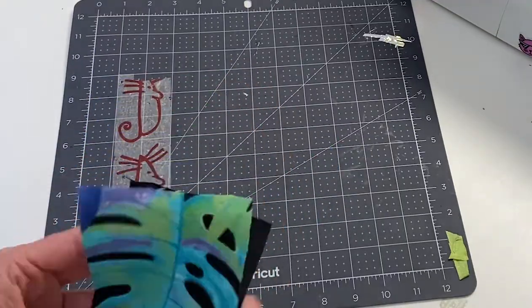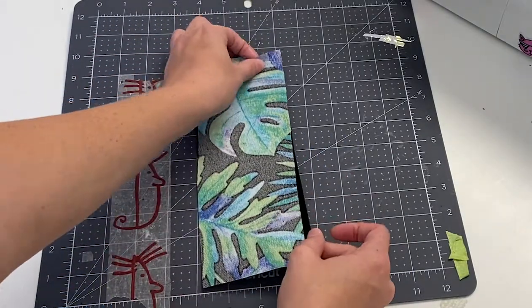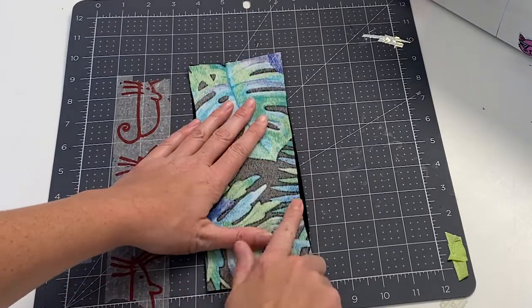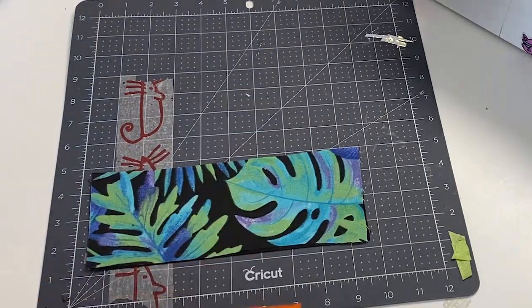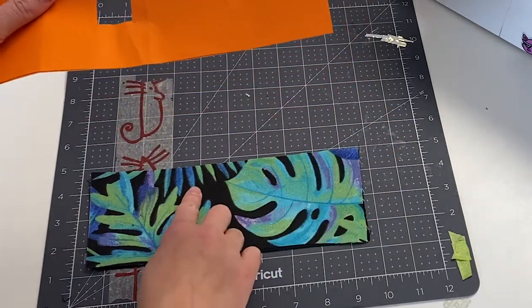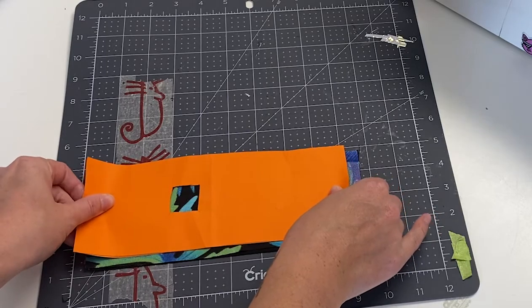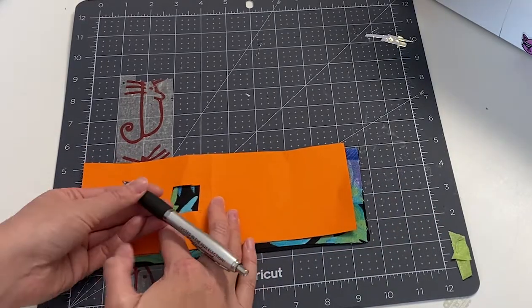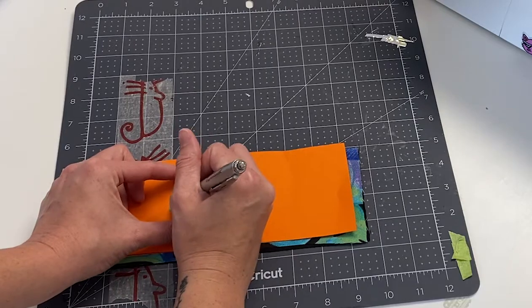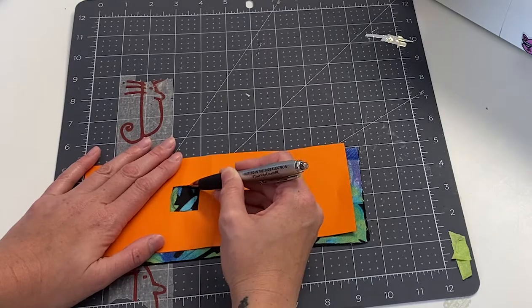I sewed the pieces right sides together around the edge and then flipped it over and sewed the other edge closed. When I cut the hole, I double-checked to make sure the hole is on the right side. Molly lost her left leg, so the hole needs to be at the top right corner of the sling — about 1 inch in diameter and about half an inch from the edge. I just drew it with pen and cut it out.